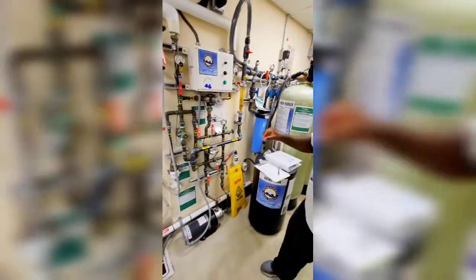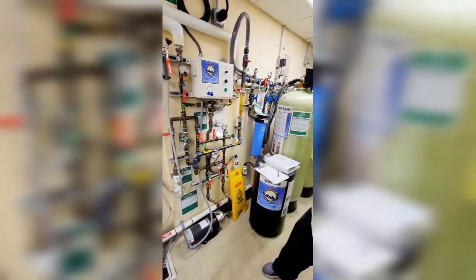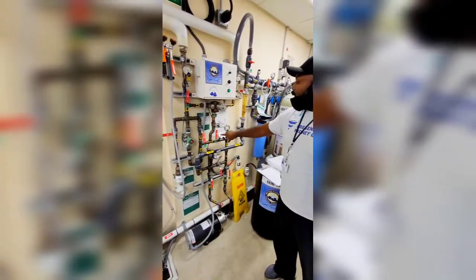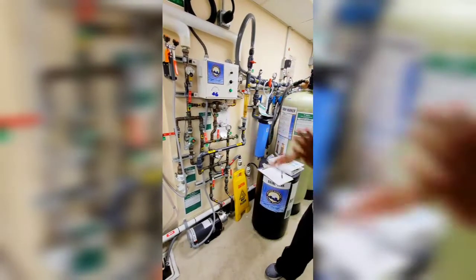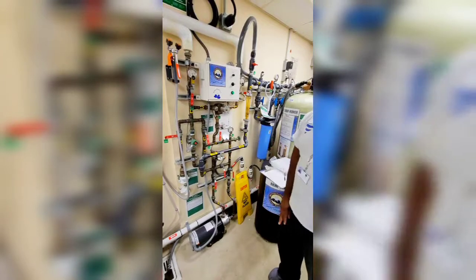It's on 79 right now, and it's not even running right now. Usually when it's actually pushing through with the ROs on, they try to keep it around 77. They can give or take a little bit — we just don't want it up to 100 degrees or down to 60 degrees or anything like that.